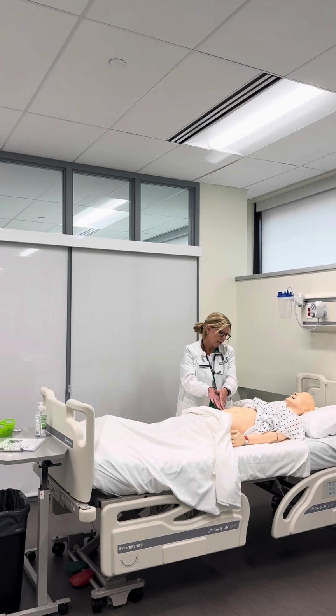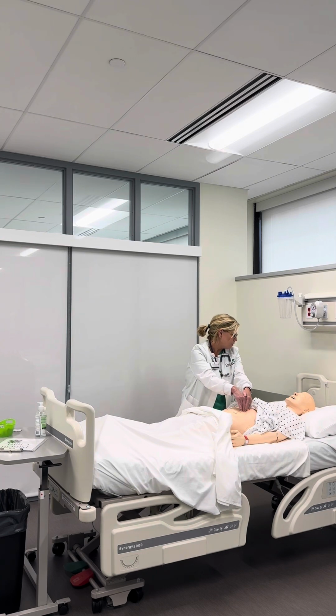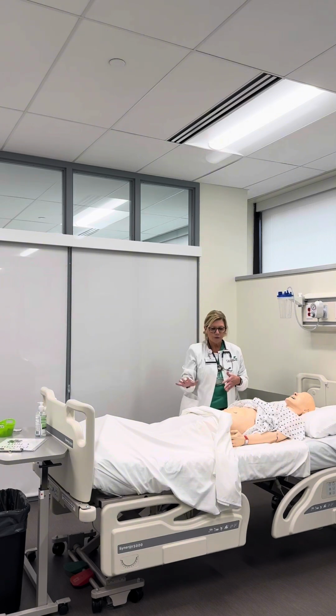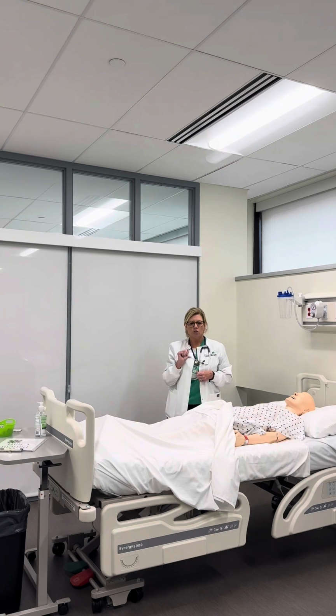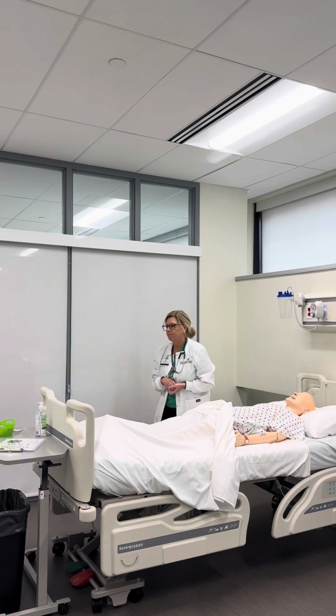So I'm just going to lightly palpate in the right lower, right upper, left upper, and then the left lower quadrant. I don't feel any masses or any distension, so that's good. So then I'm going to go over and do my G-tube medication.